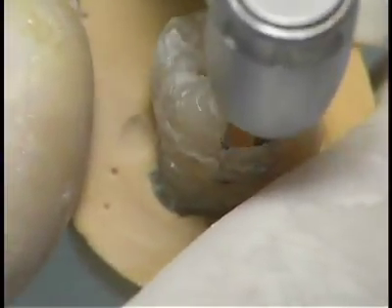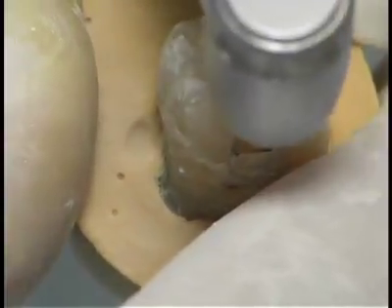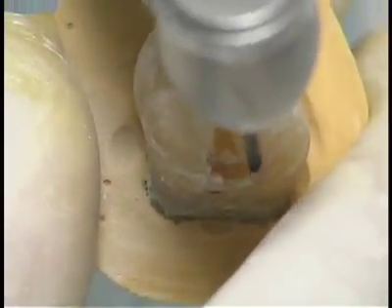At this stage, a low-speed handpiece is used to define and finish the box. With the high speed, make 2 cuts extending toward the perpendicular to the proximal surface to weaken the remaining enamel that can be removed.